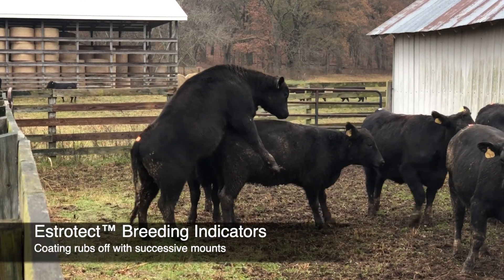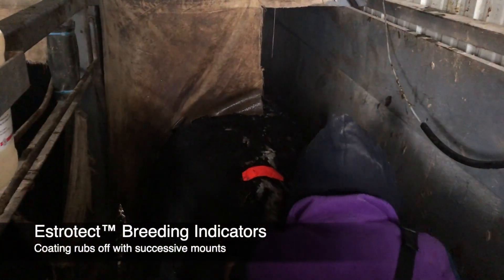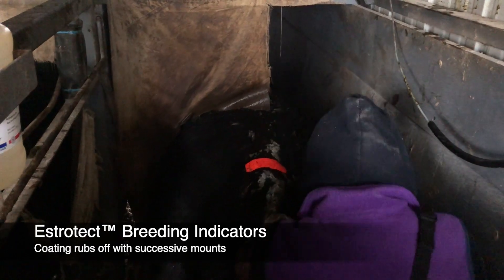This is the Estrotect tag — a very simple thing to use. It's just an adhesive tag that goes on the cow's back. You can put it across the back left to right, anywhere between the hooks and pins. Basically, she lets other females ride on her, and when 50% or more of the gray-black coating is rubbed off, you know she's had a good standing heat.